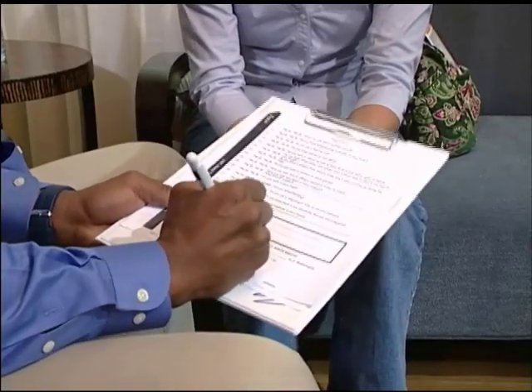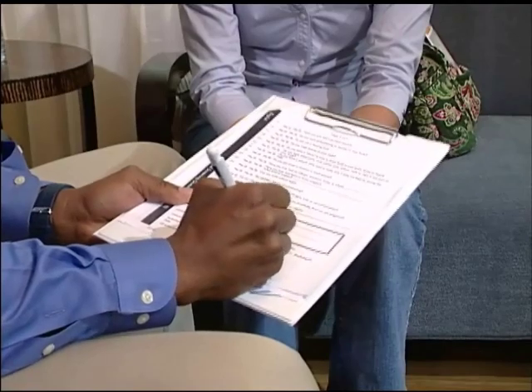Patients who do not know what type of implant or foreign object is in their body must undergo an X-ray or CT exam prior to the MR exam. Only after the physician has precluded all risk to the patient may the patient enter the examination room.